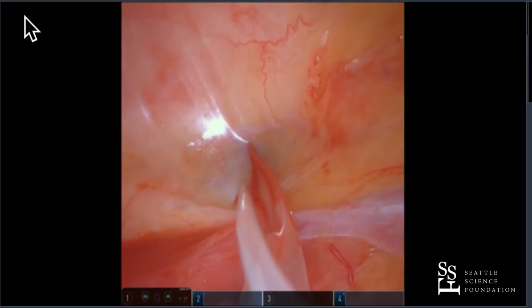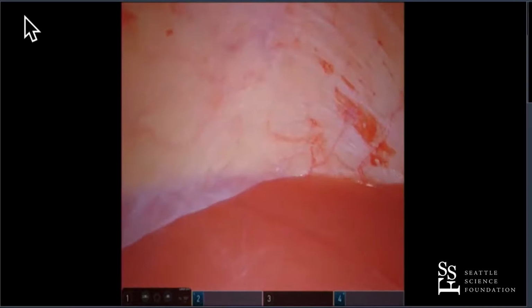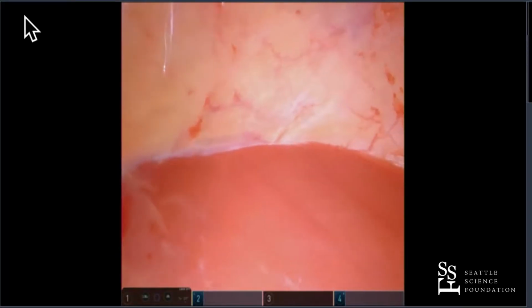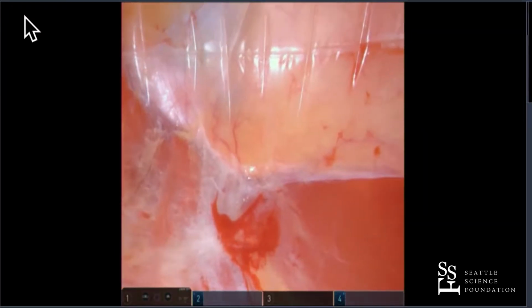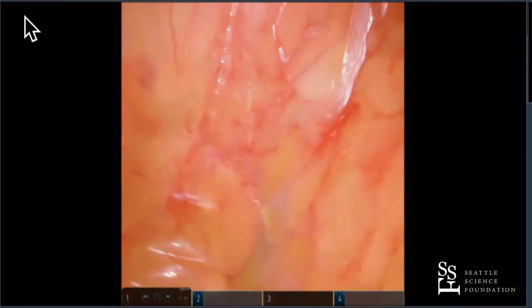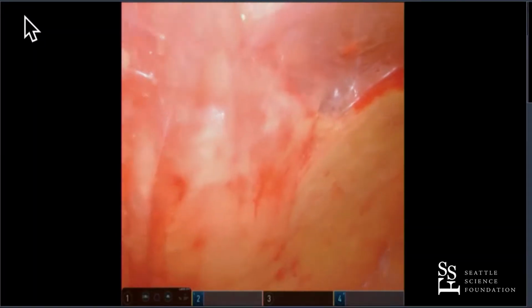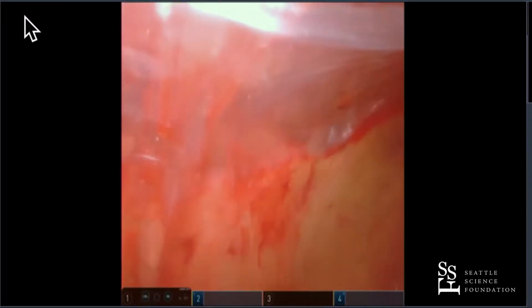Go ahead, Brando. Brando's counting. Here it is again. There's Gerota's fascia being pushed off the psoas. So I'm looking up towards the kidney now. So that's a very distinct line. Keep going, doctor. Yeah, and it's important to note, too, that even on the fattest of patients, you're going to see this anatomy. If you just see yellow all the way around, then you may not be in the right space, so don't dilate it. The other landmark we'd like to see, if we can, is the peritoneum coming off the transverse abdominis. So there's a little fold right there. It's very subtle, but that's where the peritoneum meets the transverse abdominis, right there.